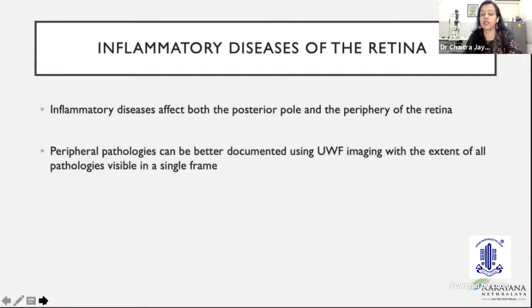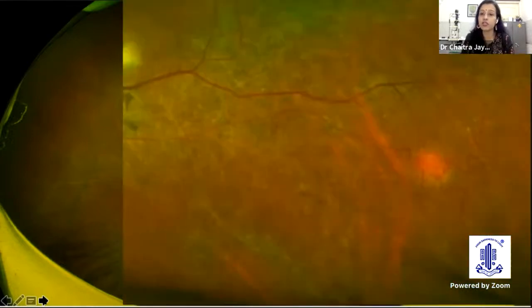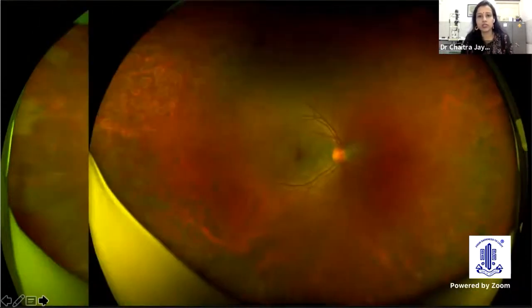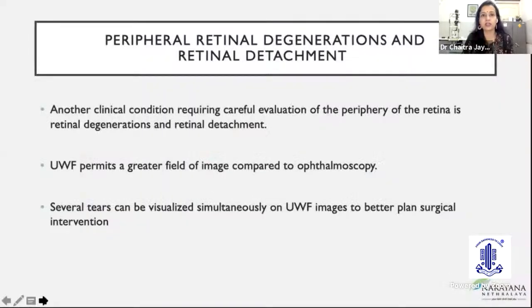Inflammatory diseases of the retina, extremely useful again because of the peripheral involvement. Now this is a patient who had syphilis, and post follow-up, we kept seeing sclerosed vessels and a lot of vasculitis. And unfortunately, there was also a vascular proliferative tumor, which we picked up on follow-up, as you can see here. This is a patient again with vasculitis. You can see the peripheral involvement, good educative tool. Post laser, you can see good resolution of the disease. This is a patient with serpiginous choroiditis. Again, extent of the disease can be well delineated here.